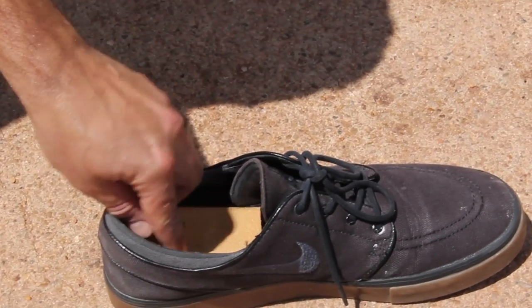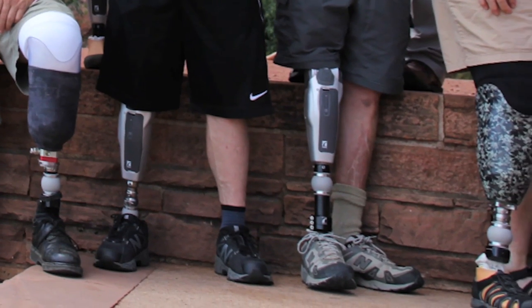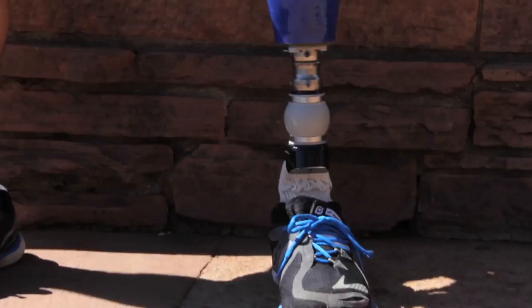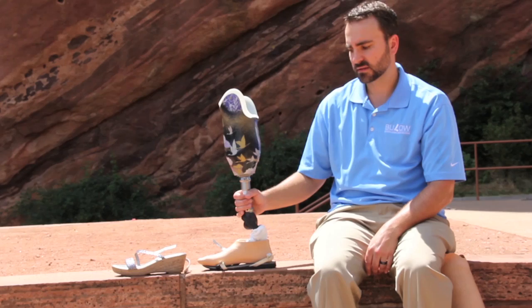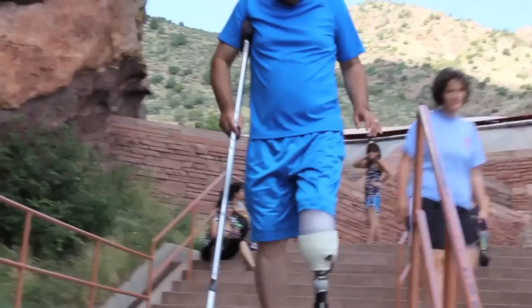Heel height and shoes. You shouldn't be limited to wearing just one pair of shoes with your prosthesis. You should be aware, though, that changing shoes can affect the alignment of the prosthesis and throw off your gait. For example, if the prosthesis was set up on a low heel height shoe and you switch to a high heel height shoe, it might feel as though you're walking downhill.